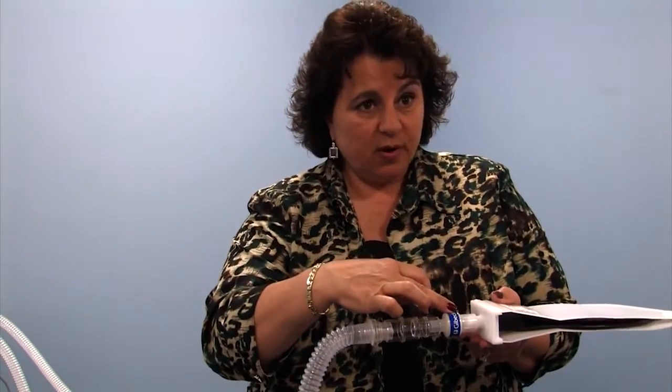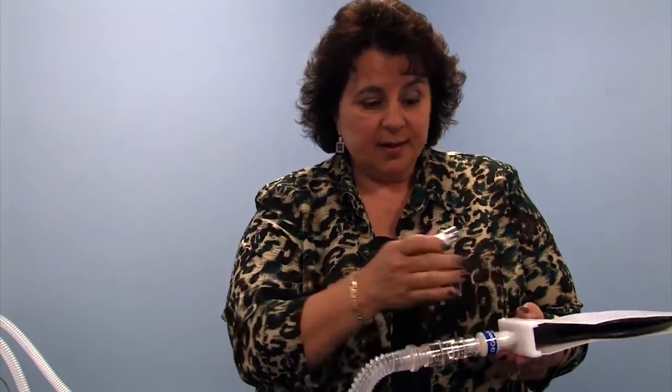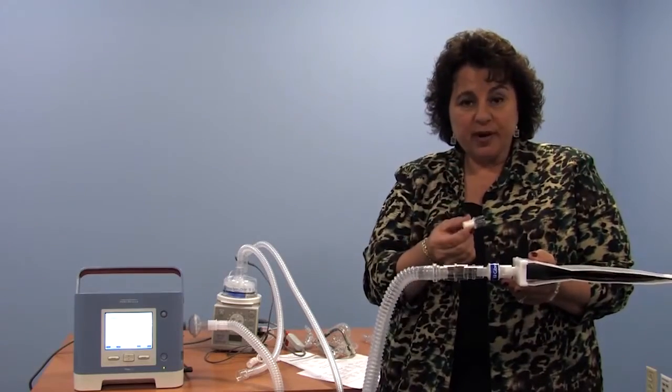This would be a neonatal infant device. This would be for a child. They come very large, but remember that this is where your child is. This is where the fresh gas is exchanged. So a great big heat moisture exchanger could create too much distance between the fresh gas and your child's body. So we need to make you aware of it.